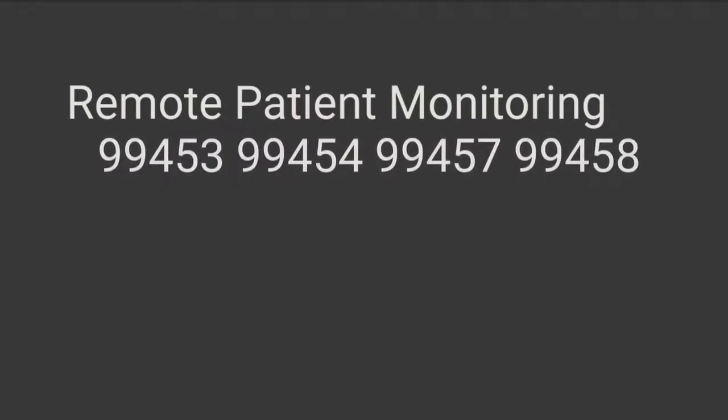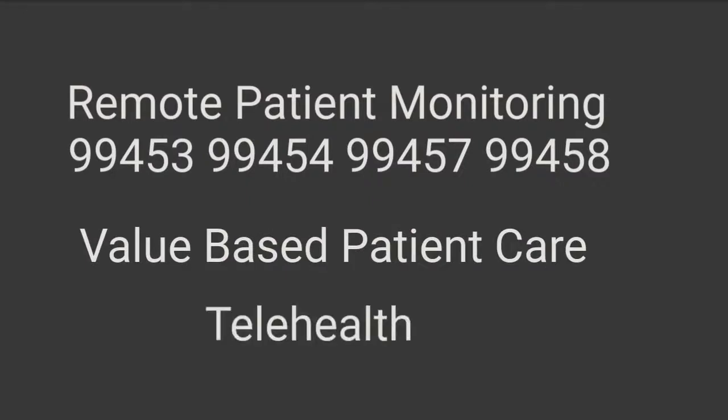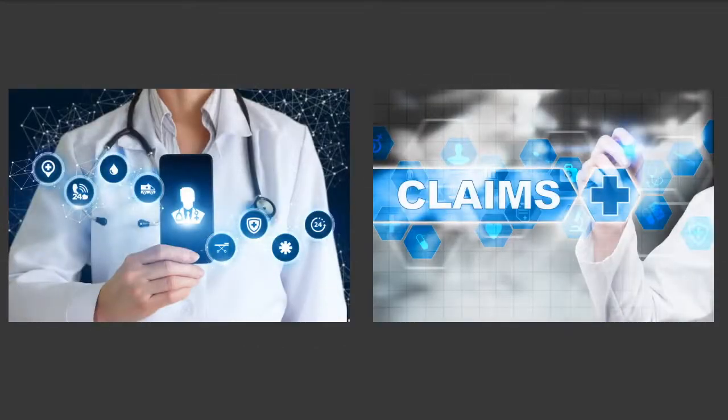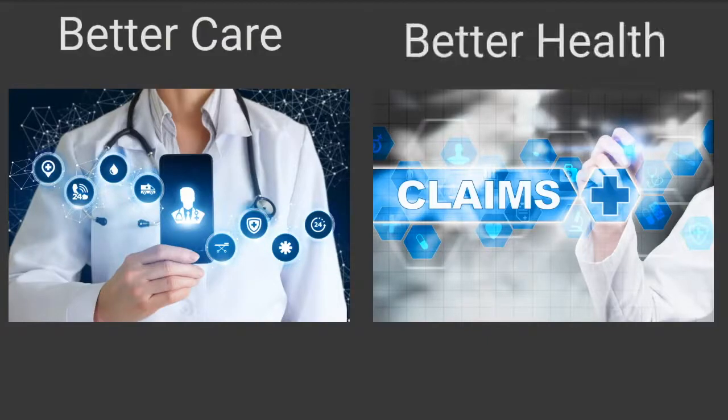The platform is designed to accommodate the needs of CMS Remote Patient Monitoring CPT codes 99453, 99454, 99457, 99458, and the value-based Medicaid initiatives, as well as the wide range of telehealth needs. These programs are part of CMS strategy to reform how healthcare is delivered and paid for, offering better care, better health with lower cost. You will see from our presentation how the software and the home monitoring equipment was designed to support these goals.